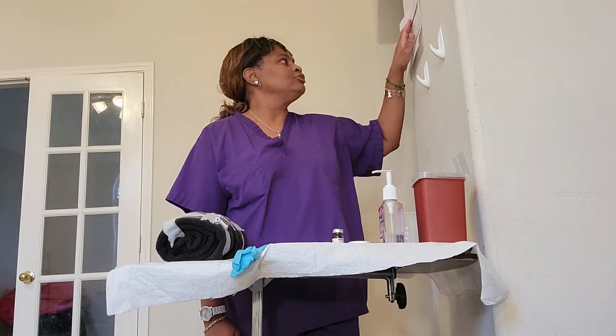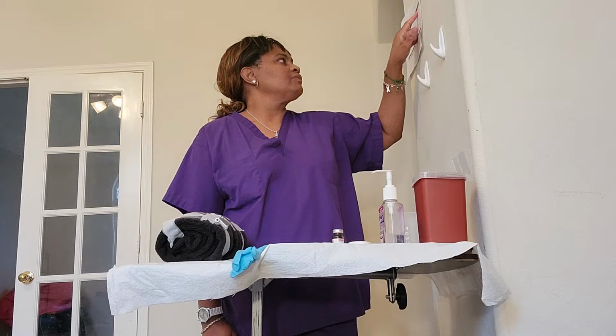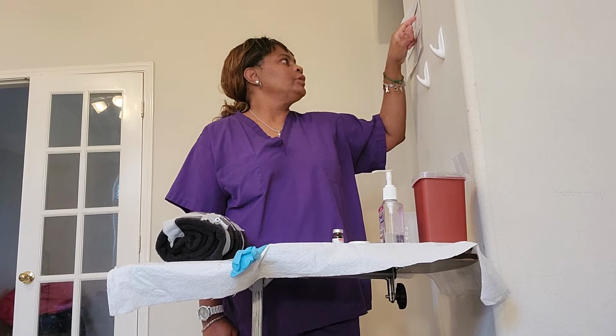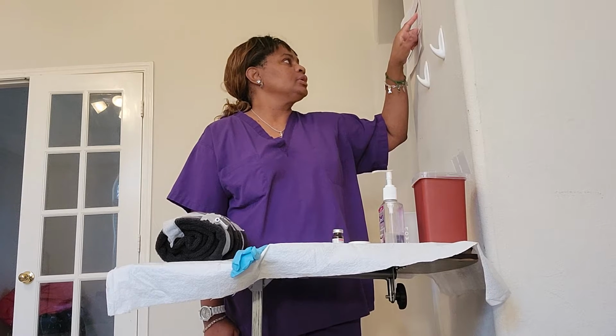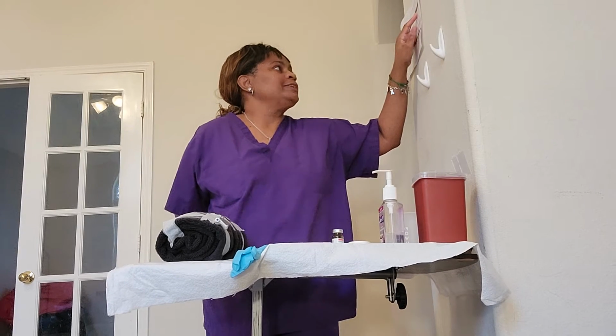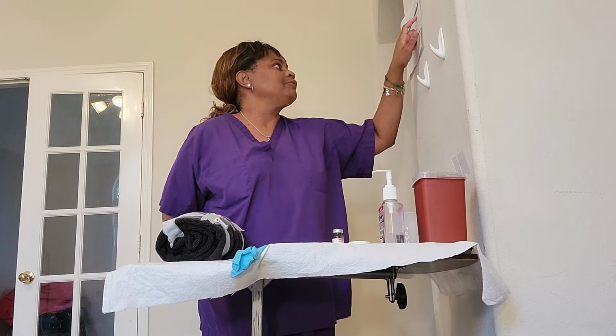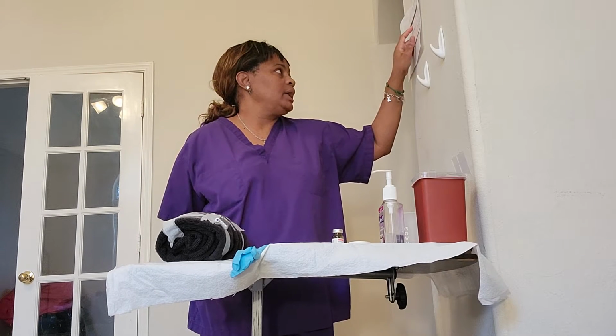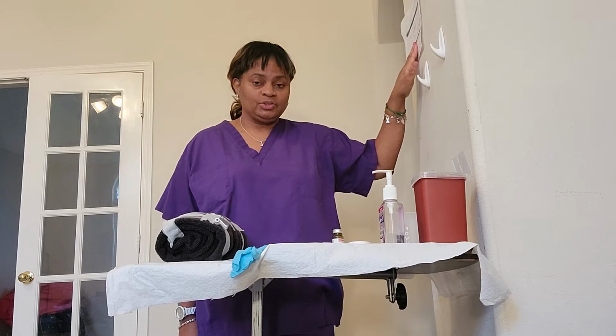She has no known allergies, and the medication we're giving right now is the furosemide 20 milligram by IV push every 12 hours. We're going to administer it over 2 minutes. We will flush with 3 mLs of normal saline before and after the dose. Time to give the medications now. It's for edema and blood pressure. That is my first check.